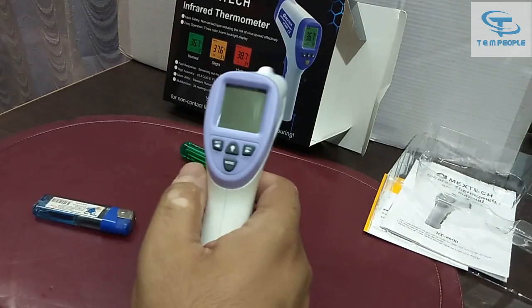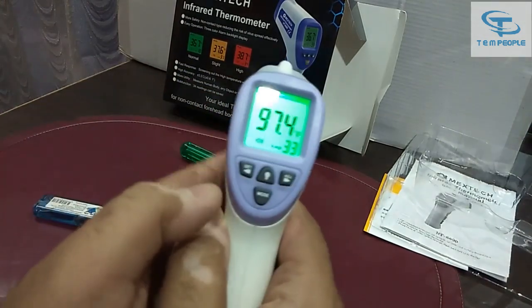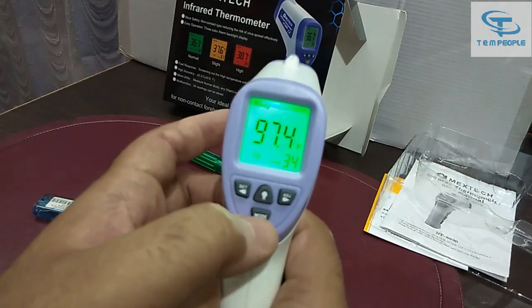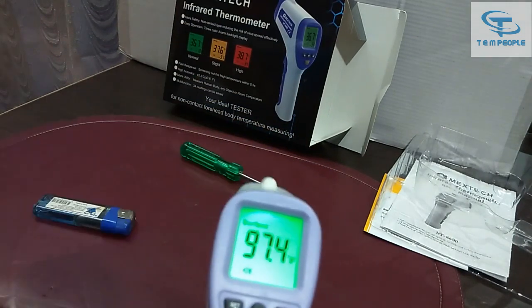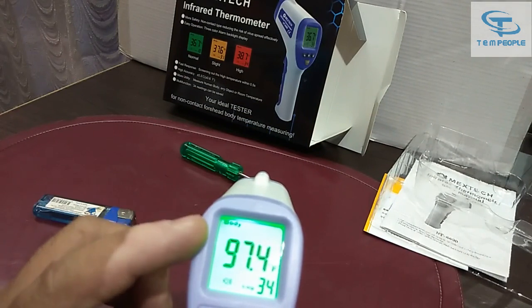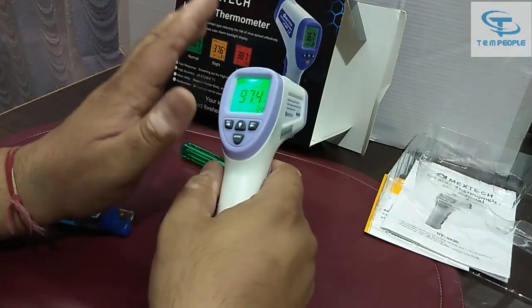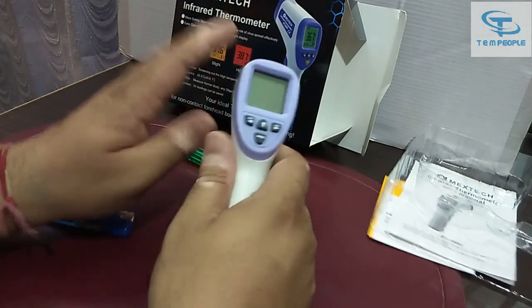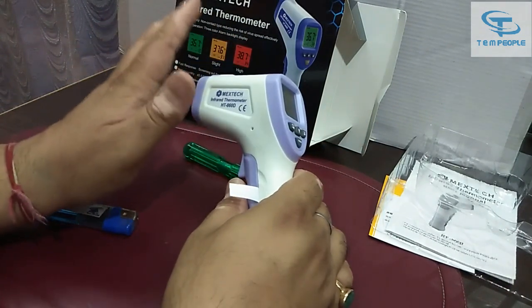If you want to change from body mode to surface mode, turn on the instrument and press the Mode button — you can see it now says 'Surface.' Press the Mode button again and it goes back to 'Body.' It depends on your use case. Note that the surface mode has a more limited temperature range.